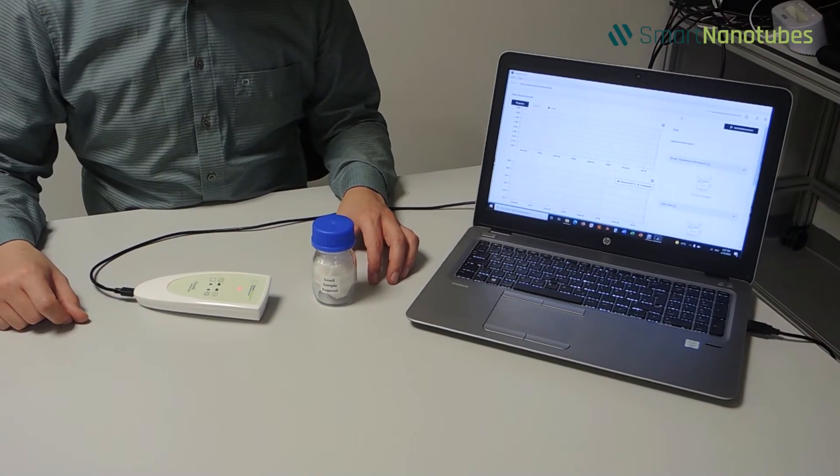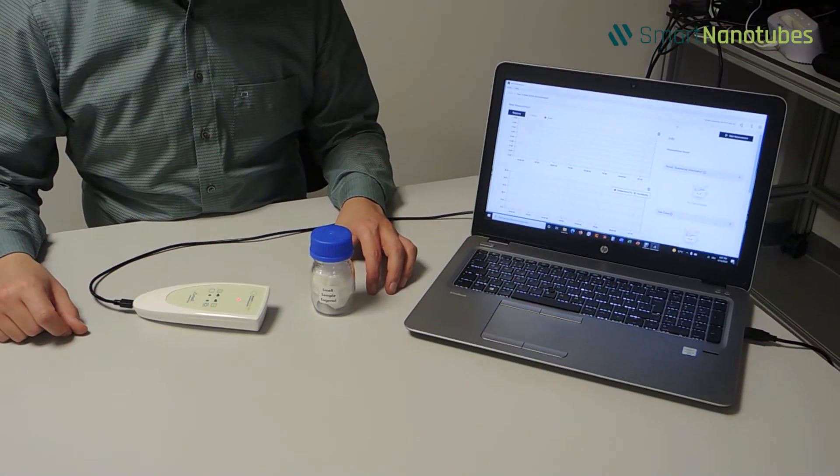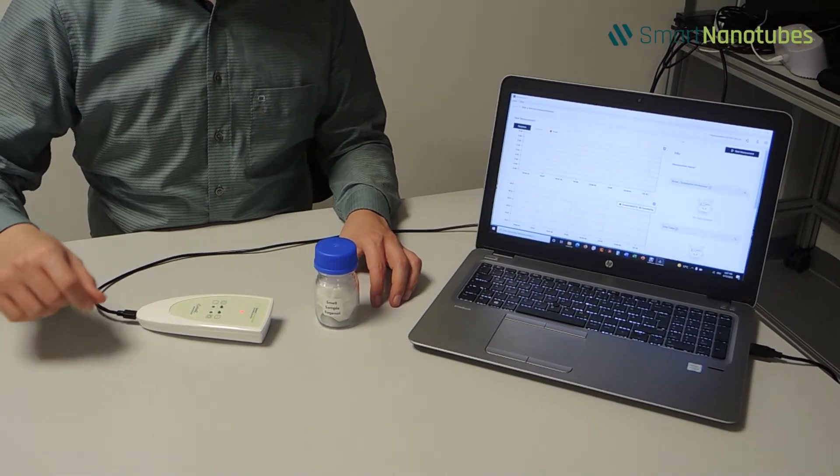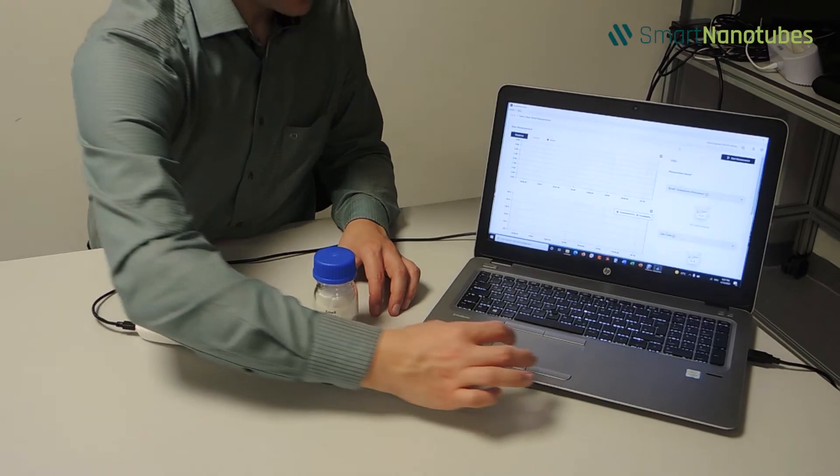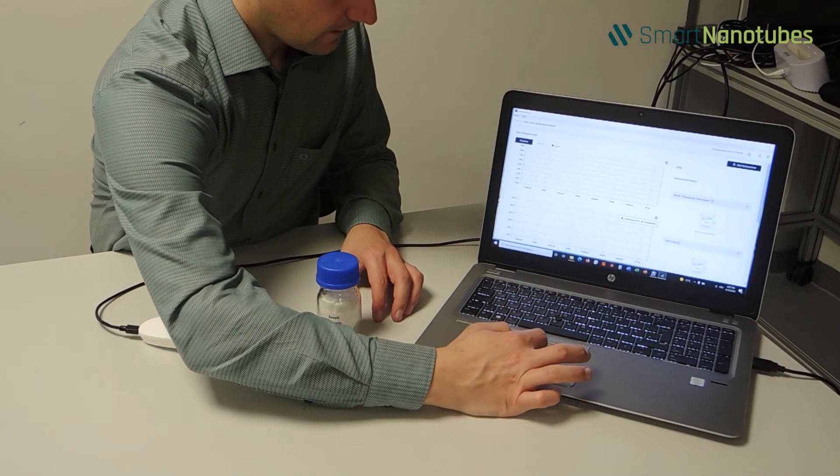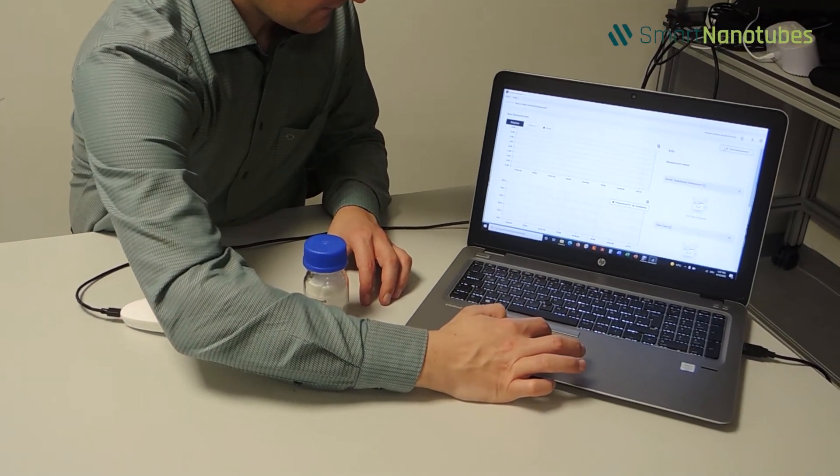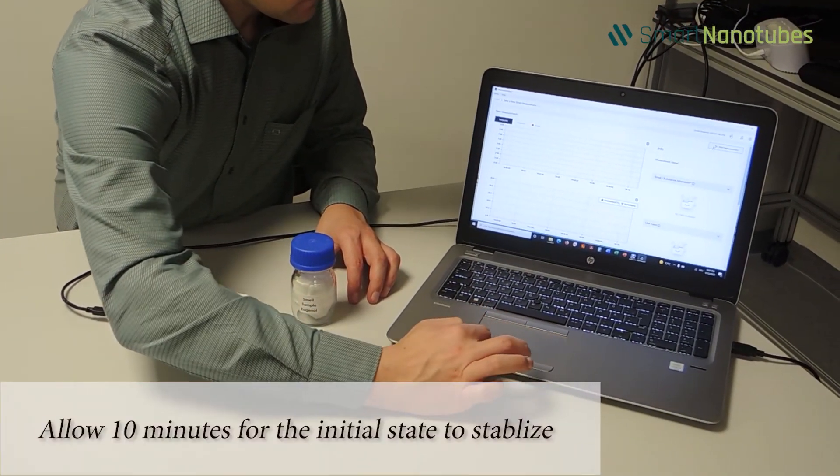Click the Start Measurement button now. The measurement starts here. Allow 10 minutes for the initial state to stabilize.